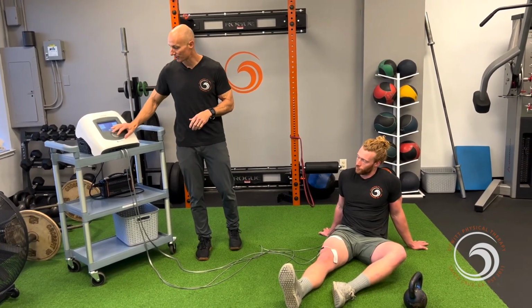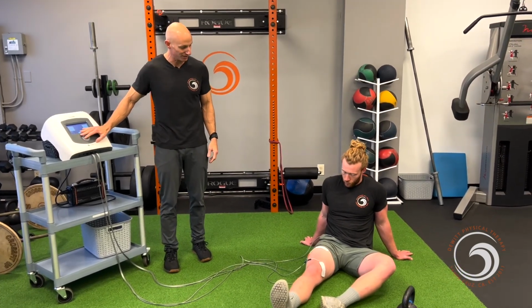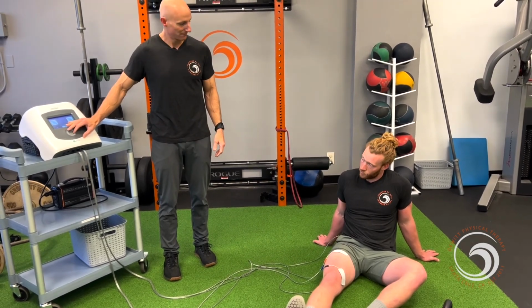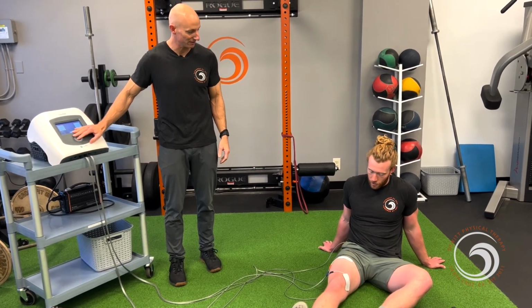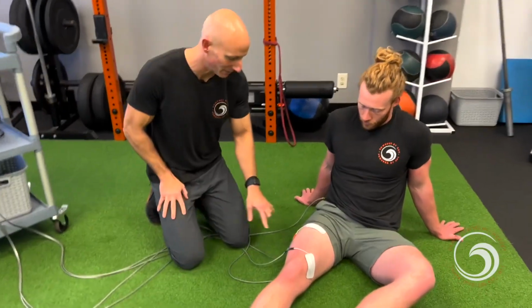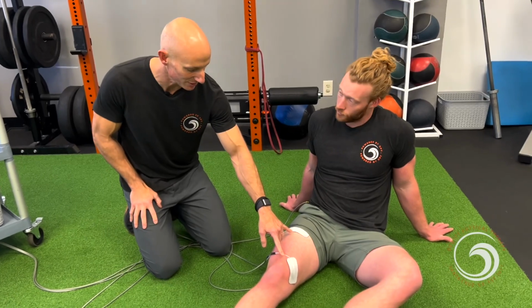So Elijah, what we're going to do is we got a pad on his VMO and his rectus femoris, and we're going to start turning that up, and tell me when you feel something. It's twitchy. Good. I want it to be about a 6 or a 7 out of 10, so I want it to be pretty strong. Great, cool. All right, so we're just focusing on the quad at this point, and we all know how important that quad is after any kind of knee or lower body injury and surgery.